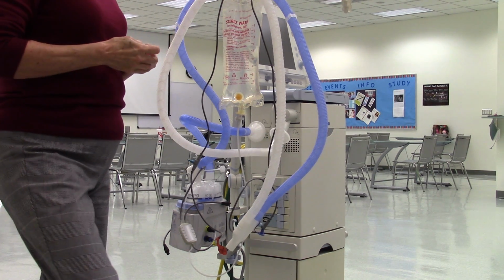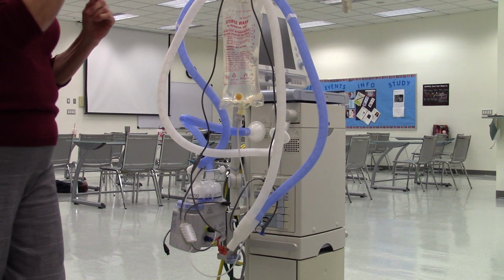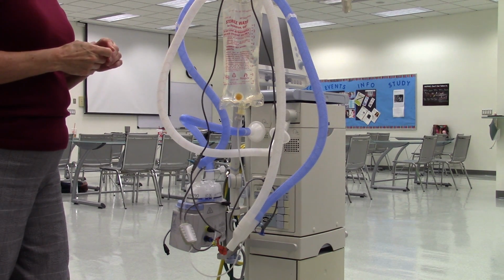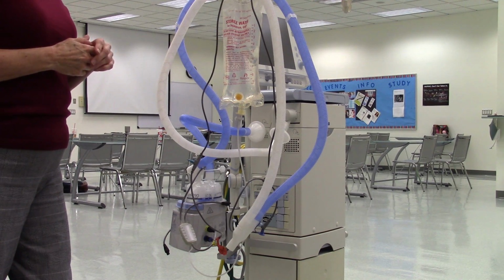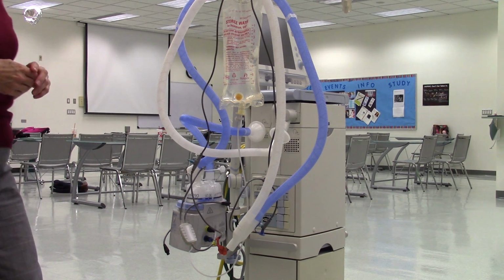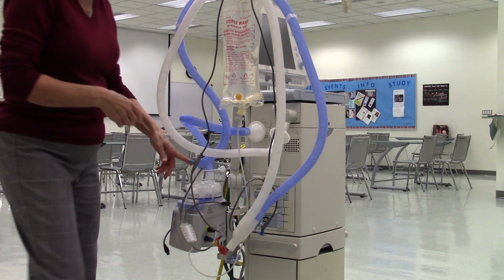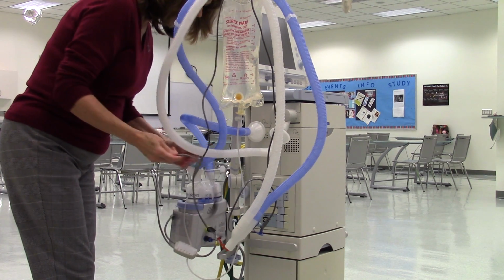What about the end? I'm waiting to see if he's going to give me directions. So it says the bottom connection blue is the temperature cable. You will notice that this cable has two sensors. Plug the sensors into the proper ports. One sensor is plugged into the circuit where the circuit attaches to the water chamber.